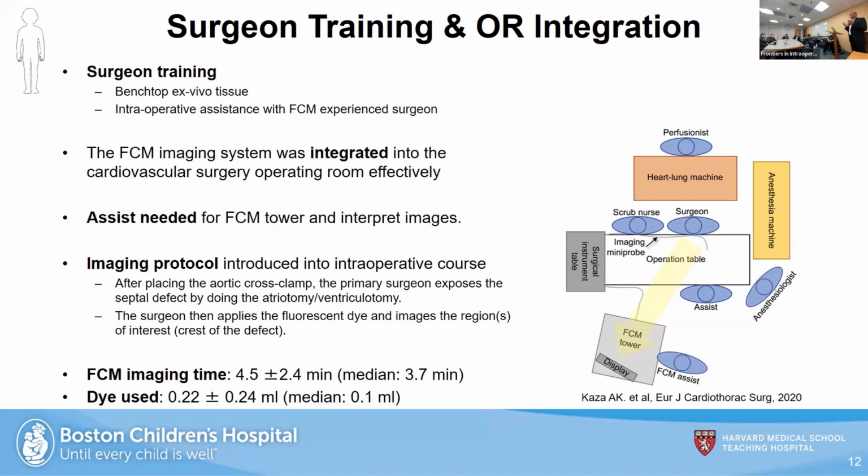We were successfully able to integrate the system into the OR, as shown here. The FCM system is kept on the left-hand side of the OR table, and the screen is placed directly facing the surgeon.